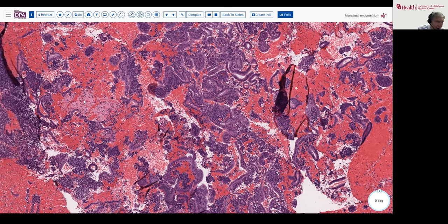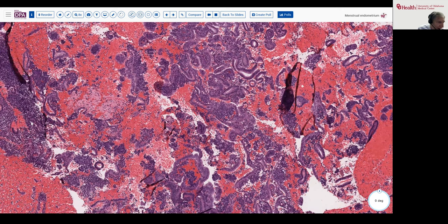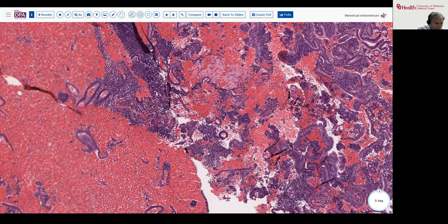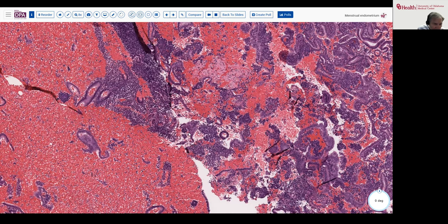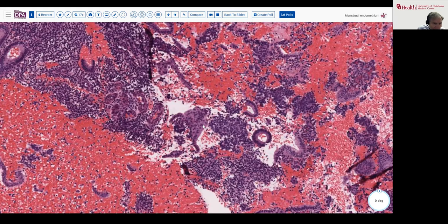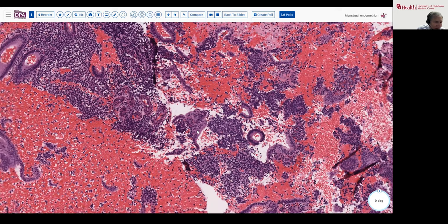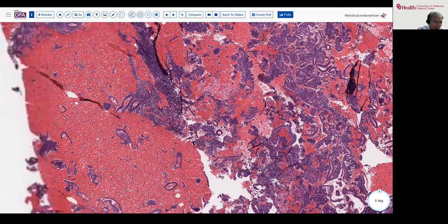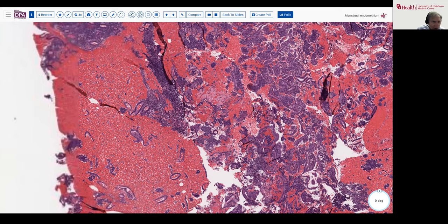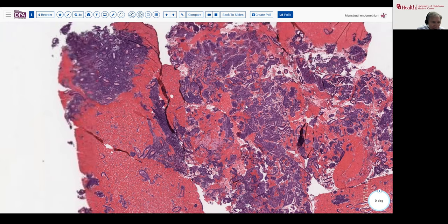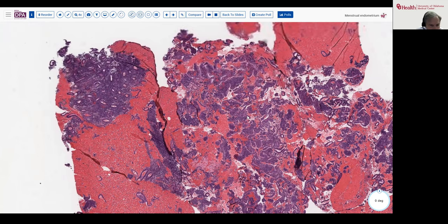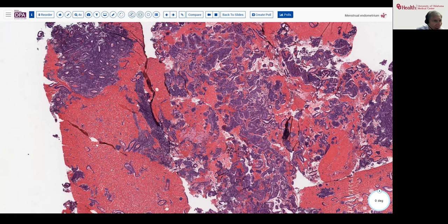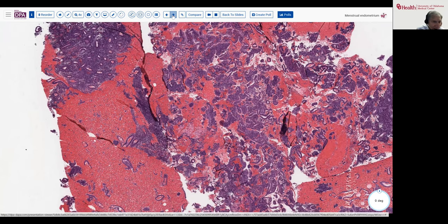Here's a little of the syncytial change we can see, and some fibrin and thrombi as well. Here's the syncytial change as the cells become multi-nucleated around these little nests of stroma. The important thing in this situation is to not mistake a menstrual endometrium for hyperplasia or for papillary carcinomas that have become hemorrhagic. Let's take a look at another example.